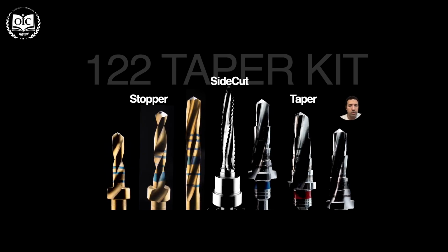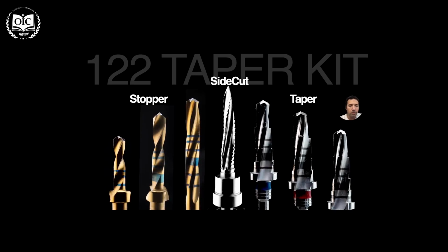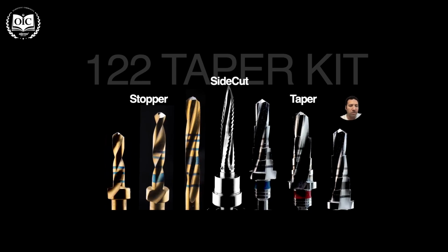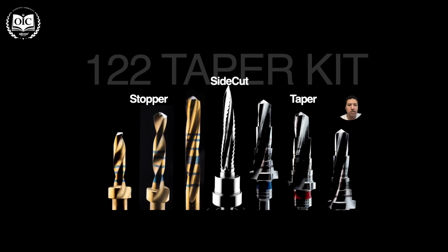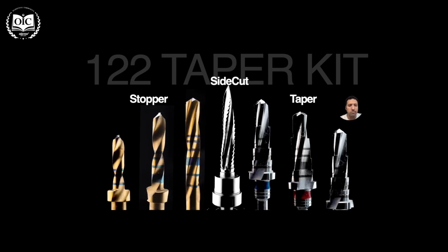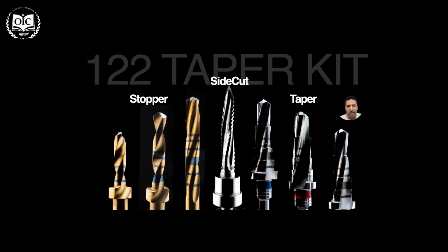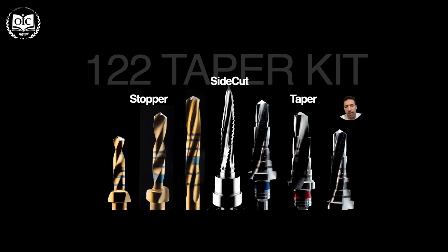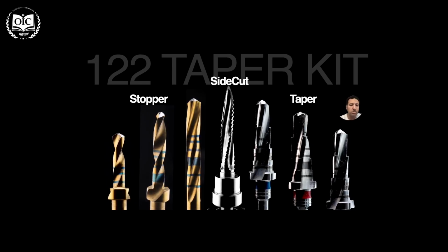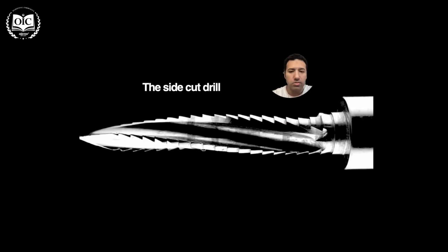All conical connection implants, better to place them maybe 1 to 2 millimeters subcrestally. So see the marking on these drills. For example, the blue one is the final drill for the 4.5 implant. The final line, black line, indicates the length of the implant. Then you have an extra 1 millimeter to the bigger flat stopper to just make things easier and place the implant 1 millimeter subcrestal without having to calculate this 1 millimeter in your drilling on the drill.